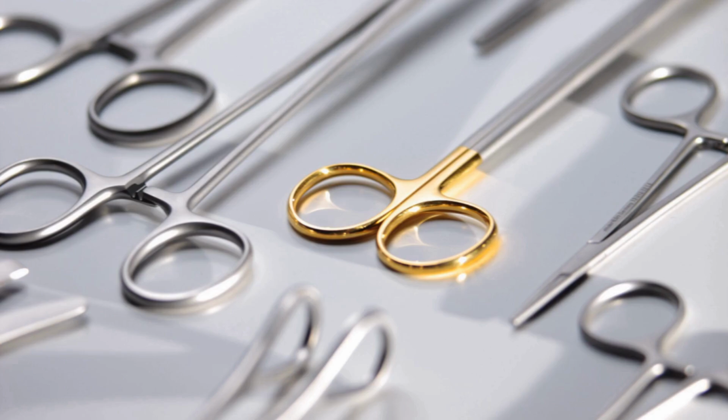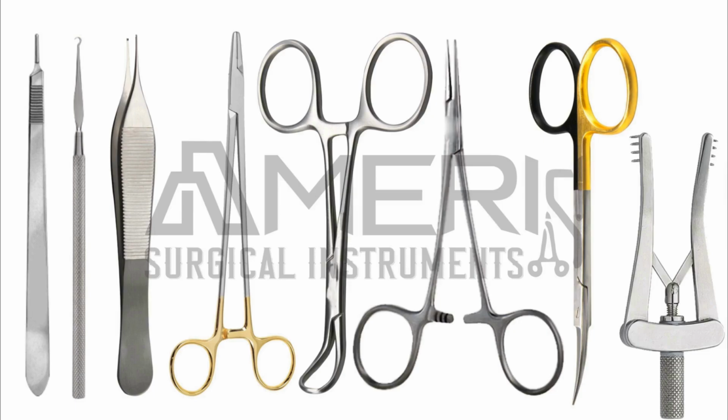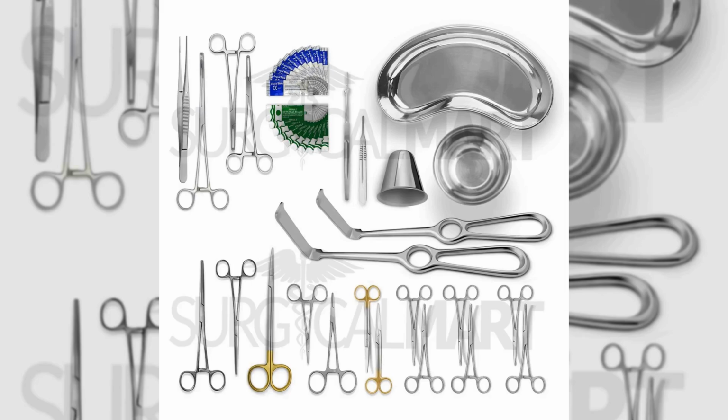Grasping and holding instruments. Examples: forceps, used to hold or grasp tissues, materials, or other instruments during surgery. Needle holder, specifically designed to hold needles for suturing. Clamping and occluding instruments. Examples: hemostats, used to clamp blood vessels to control bleeding. Clamps, used to occlude vessels or tissue.